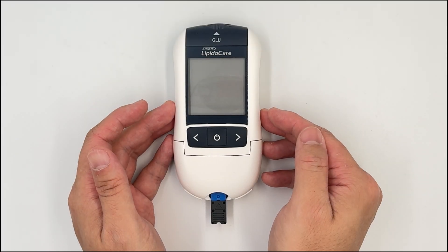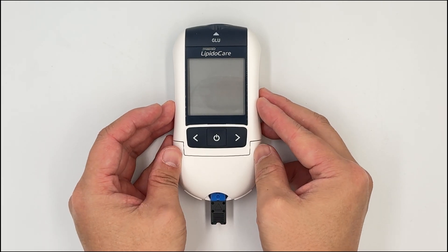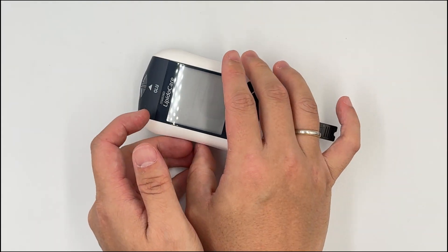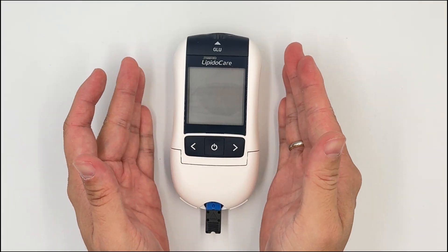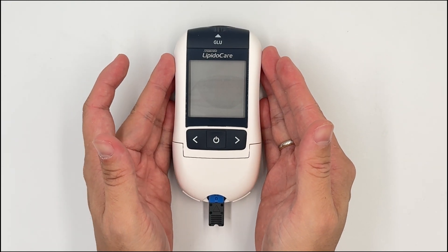Tip number four: when the machine is doing the countdown and analyzing your test, please do not move it. Do not change its position — just leave it as it is. We do not want to mess up any of the results.